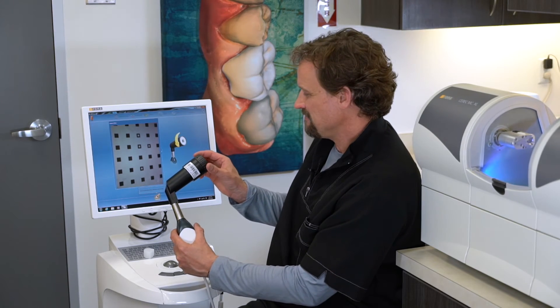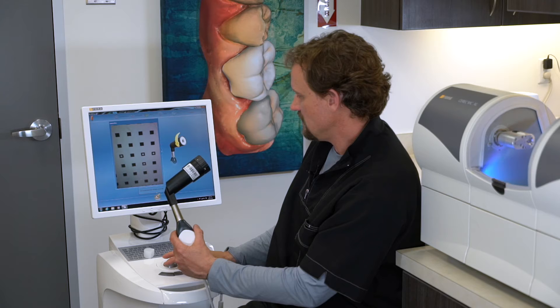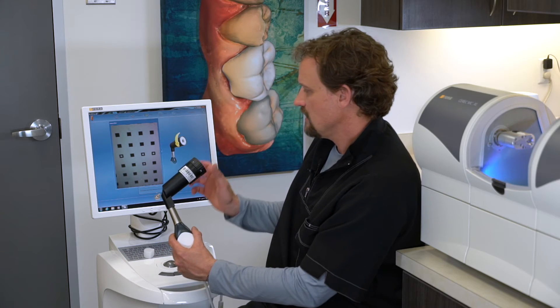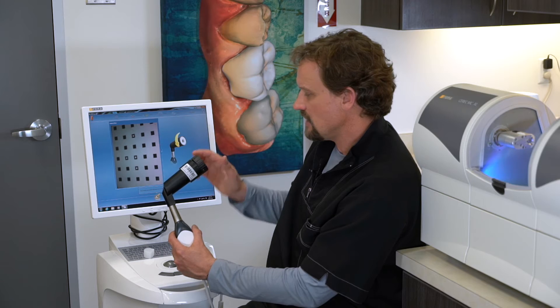It's going to tell you to do it again. Turn it until it clicks and hit OK. You just keep doing this all the way out until it tells you to stop.